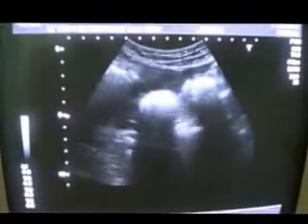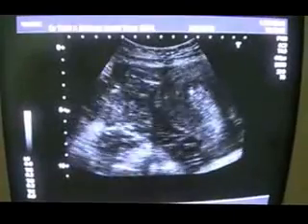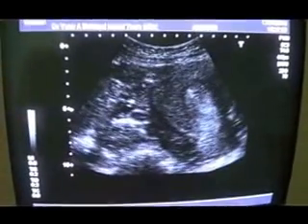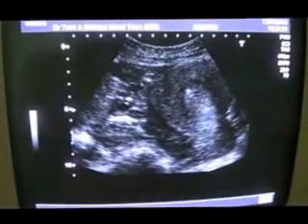From here I am moving downwards into the pelvis again, and this is the story, a case of ruptured ectopic pregnancy. Thank you very much.